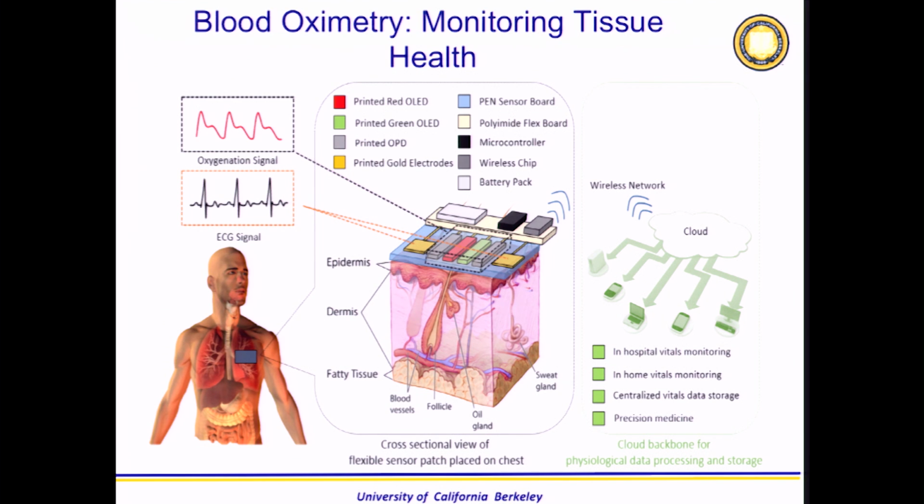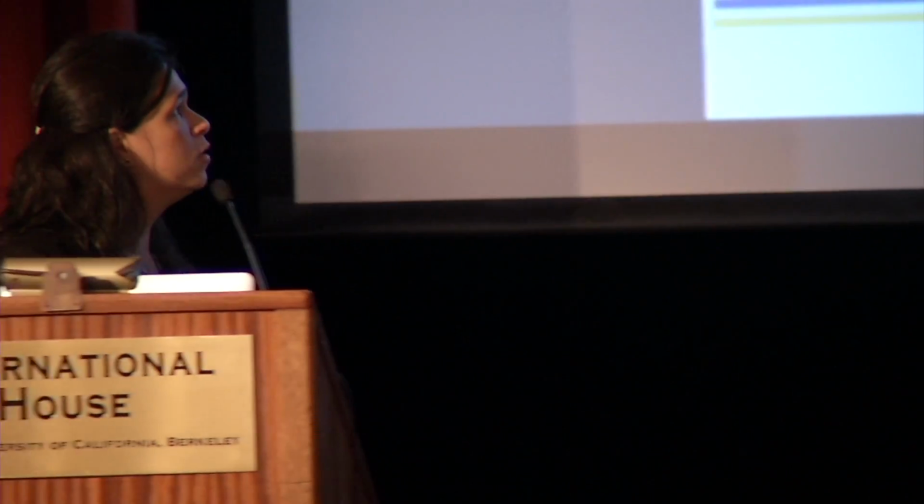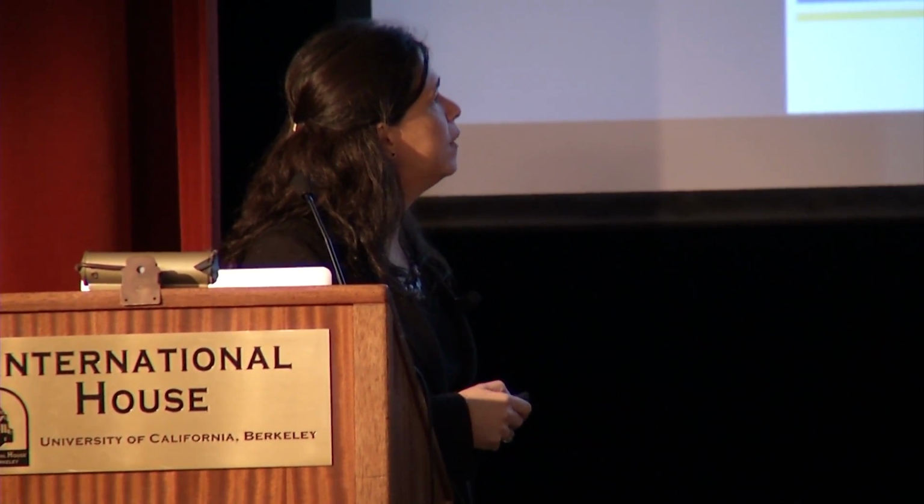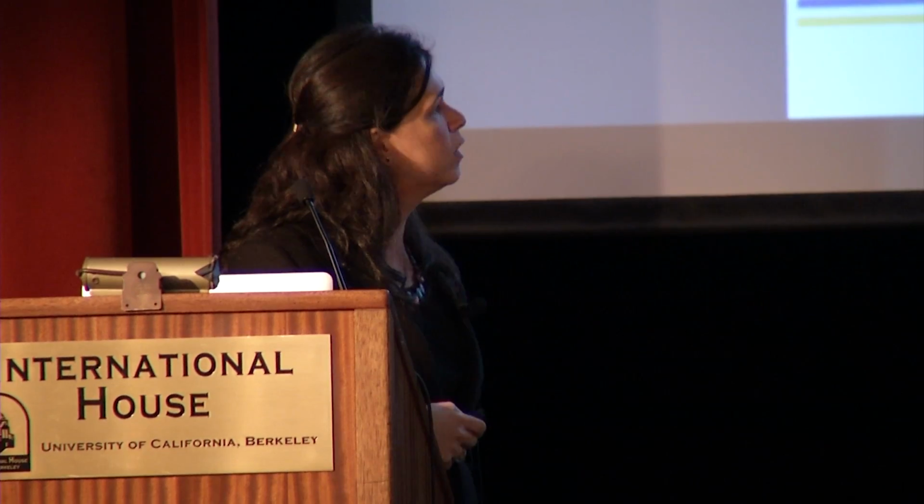So we are adding to our bandage, we are measuring ECG, we are measuring temperature, and the local oxygenation as well as the central oxygenation. We had to change the design. We are measuring now by reflection instead of transmission, but this is very exciting work that we are doing in partnership with UCSF.